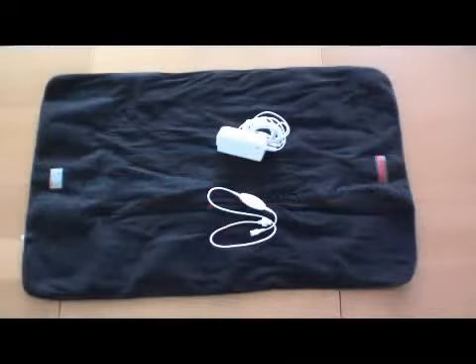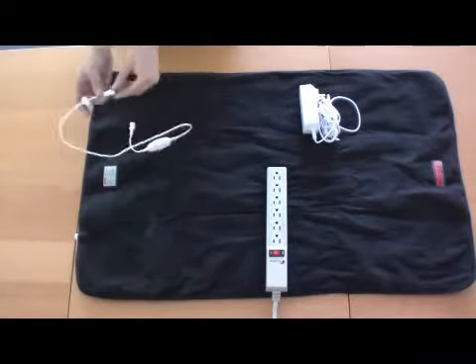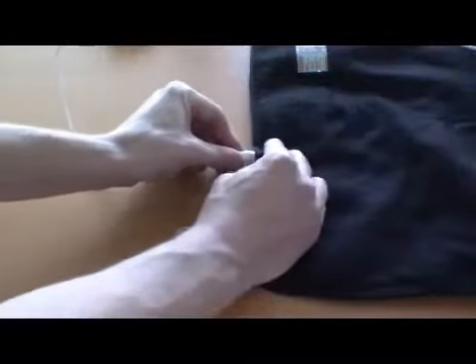VentureHeat's heated deluxe pad comes with a power adapter and controller. To use the heated pad, first plug the temperature controller to the pad. Be sure to tighten the connector fully to secure the connection.